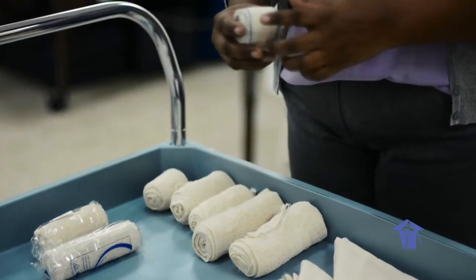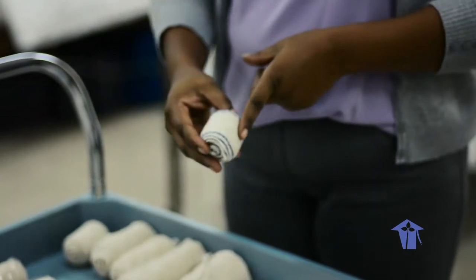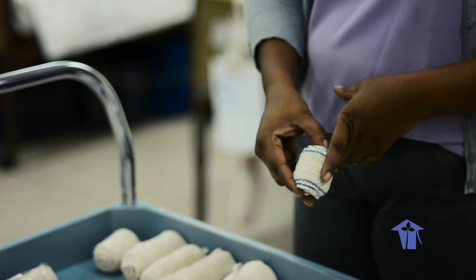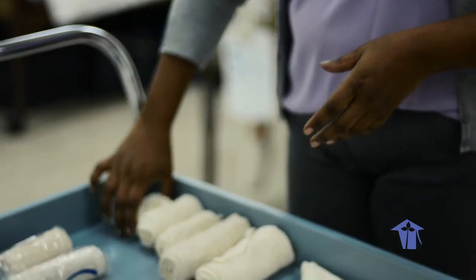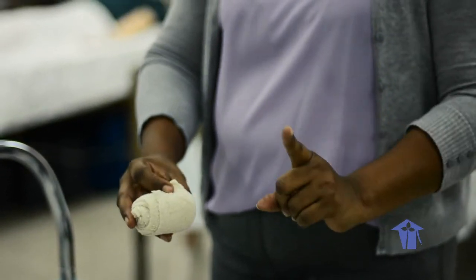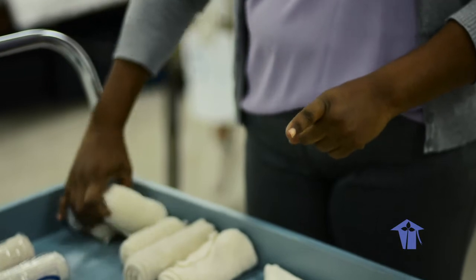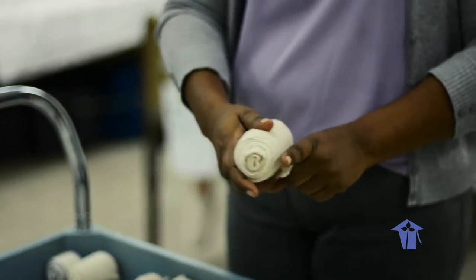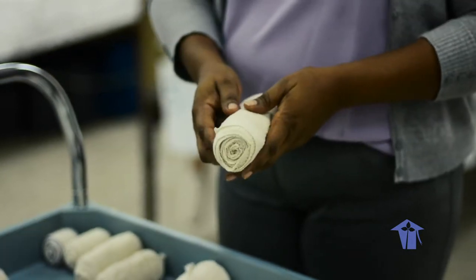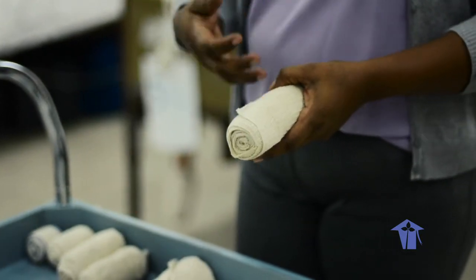You have your approximate two-inch bandage, which would be used to wrap a finger or even a small wrist, or for a very small person. You have your three-inch — you can use your finger as an indicator of how wide a bandage is. This is a three-inch bandage, this would be a four-inch, and this would be a six-inch. The larger-sized bandages we tend to use for wrapping a limb like a leg, head, or a stump.